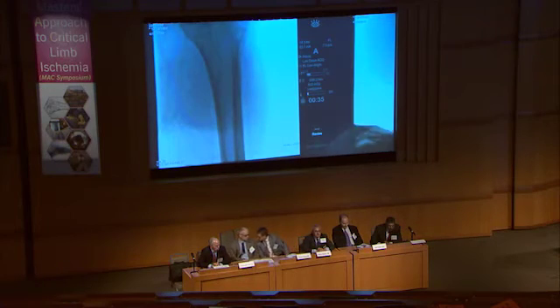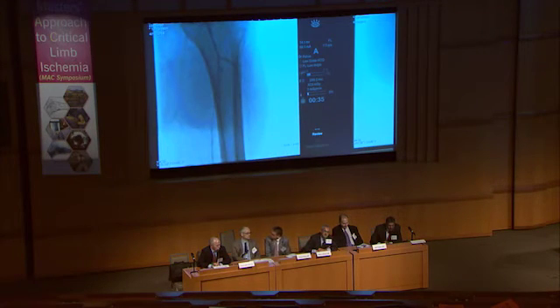So maybe in the nearly 4 minutes, you're going to attempt to cross the AT occlusion, it seems, and you have the same equipment, or you still have the Pilot? Have same equipment. Come down a little bit. Yeah, come down. So we are in the proximal AT, so we're going to get inside and then reposition our wires because it's in a branch.